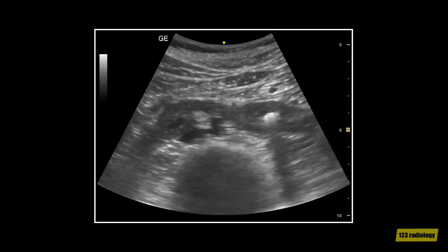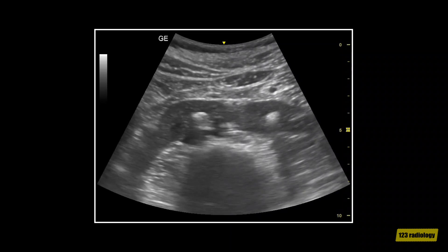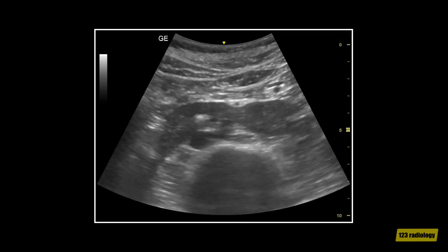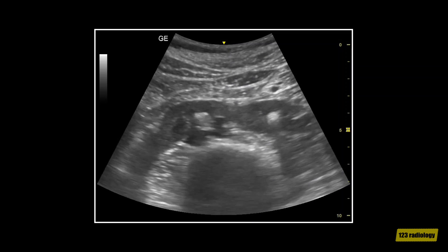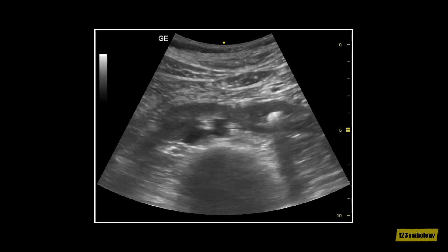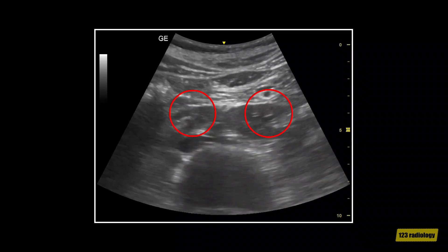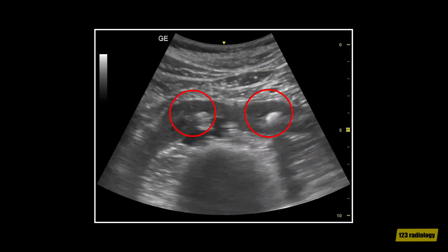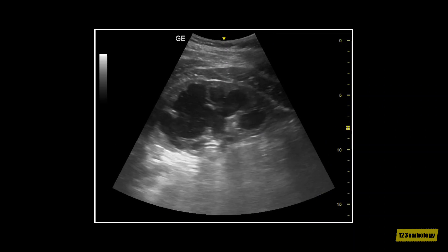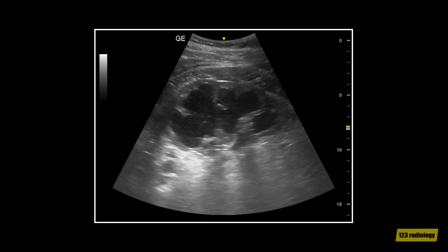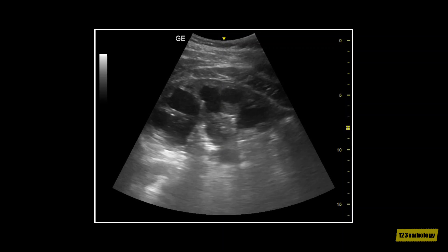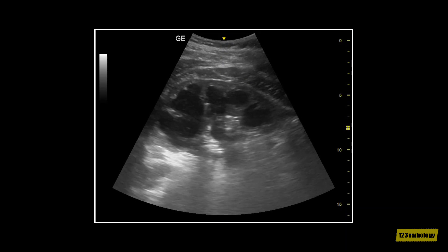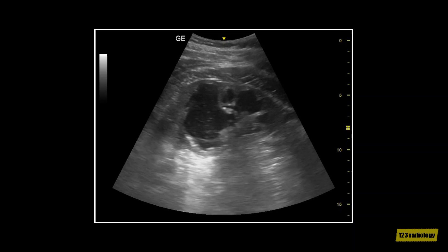This is a transverse view of the abdomen showing the renal isthmus in a patient with horseshoe kidney. The isthmus is seen anterior to the aorta and inferior vena cava. As you can see, there is bilateral renal stones, as the red circles are outlining. This is a longitudinal view of the left kidney in the same patient, which shows marked hydronephrosis with thinning of the renal parenchyma.